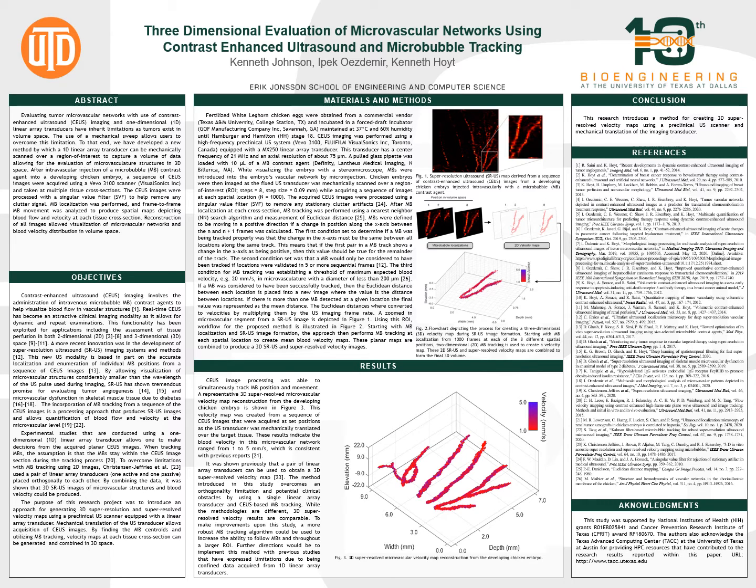The research that I am presenting is the same that I presented at the IEEE International Ultrasonics Symposium at the beginning of September. Three-dimensional evaluation of microvascular networks using contrast-enhanced ultrasound and microbubble tracking. Evaluating tumor microvascular networks with contrast-enhanced ultrasound imaging and a transducer to collect data that produces 2D images inherently has limitations, as tumors exist in volume space.